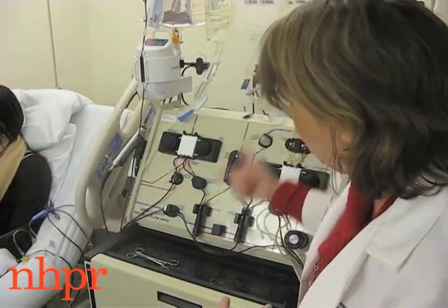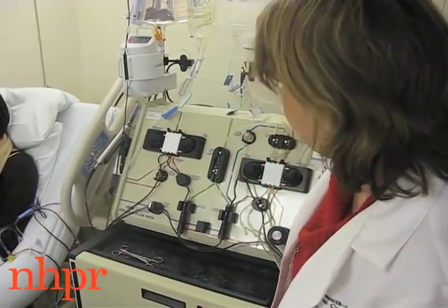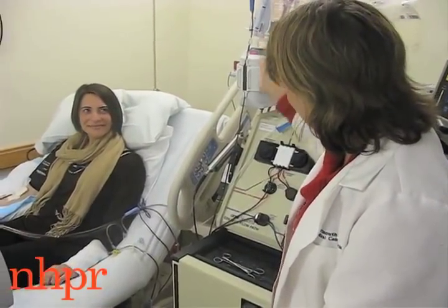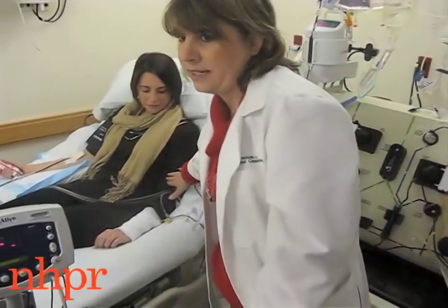As the blood is going through, it's separating it out and collecting the stem cells. This tubing going through here is a blood warmer, so that Emily doesn't get chilled. And then the blood is going back to her through the second IV line.